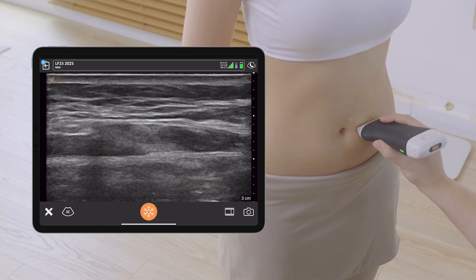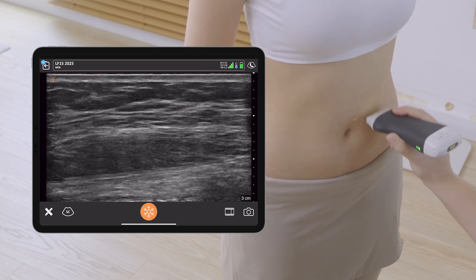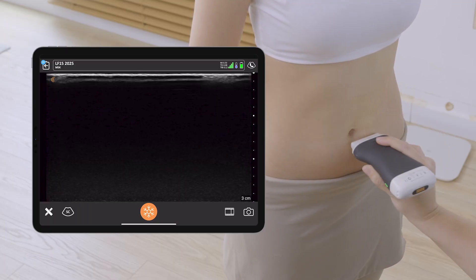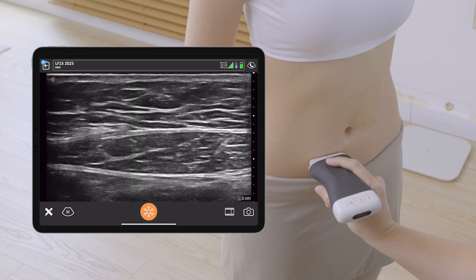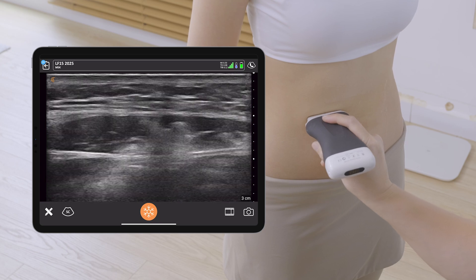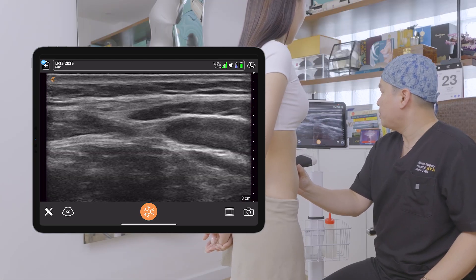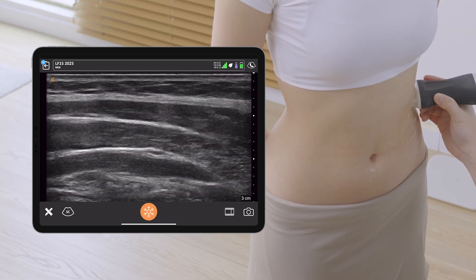Just a quick scan looking for any abnormality up and below. In the middle of the abdomen, the linea alba — above the umbilicus, below the umbilicus, and then the right side of the abdomen. Then I assess the linea semilunaris and the oblique muscle group and the waist.